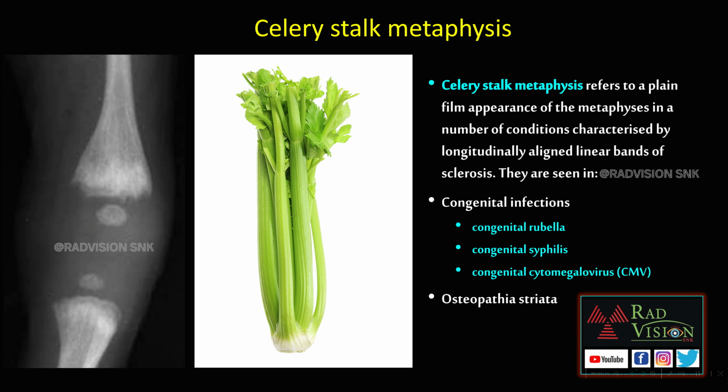So celery stalk metaphysis refers to a plain film appearance of metaphysis, which has multiple longitudinally aligned linear bands of sclerosis, commonly seen in congenital infections like congenital rubella, congenital syphilis, or congenital CMV infections, and even in osteopathia striata.